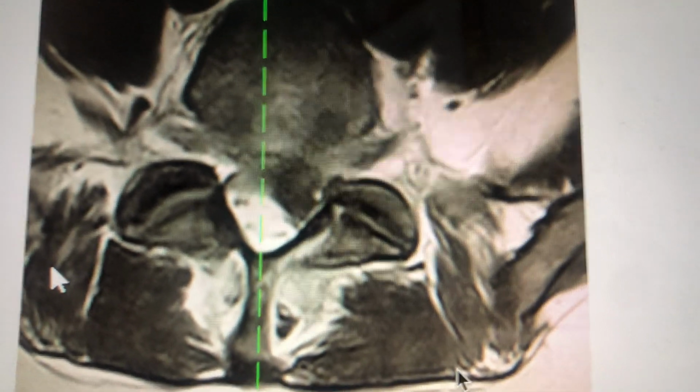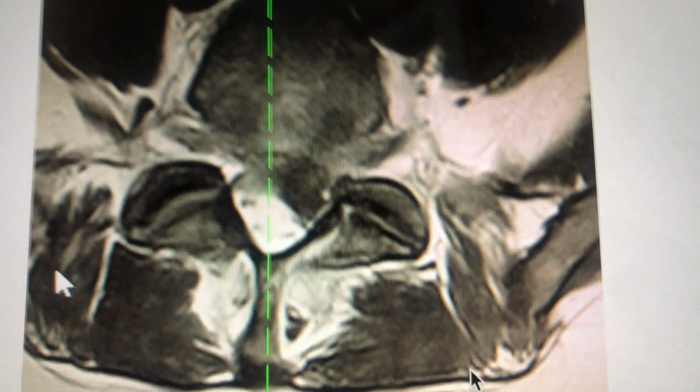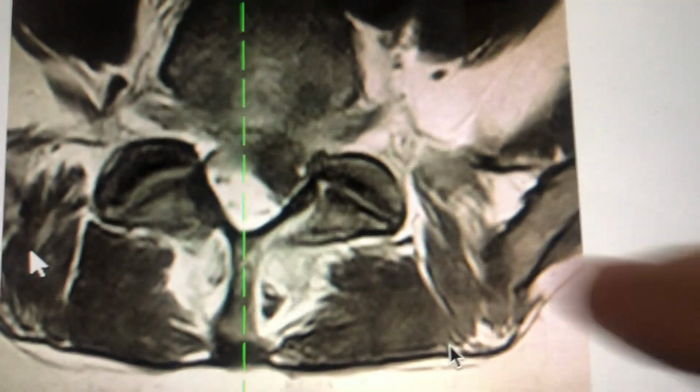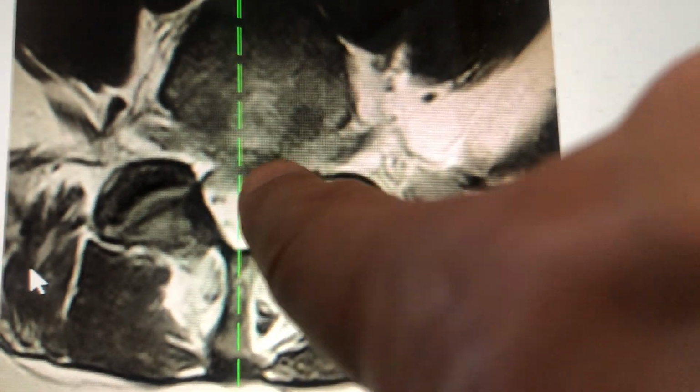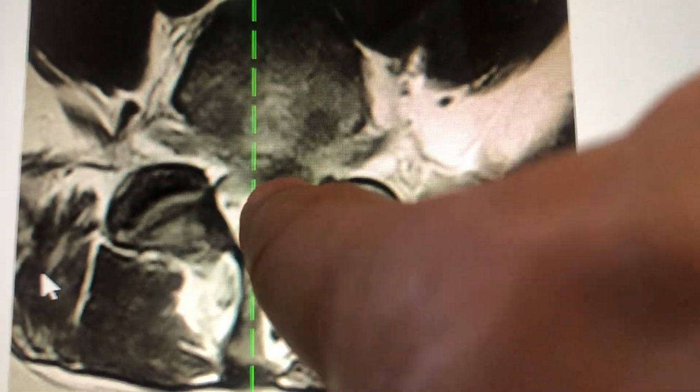Short of that, people need surgery based on their pain, and if the pain's not severe, irrespective of what the disc looks like, you don't have to get surgery. But anyway, you see all this mass should not be there. It should all look that white color, right, all there.